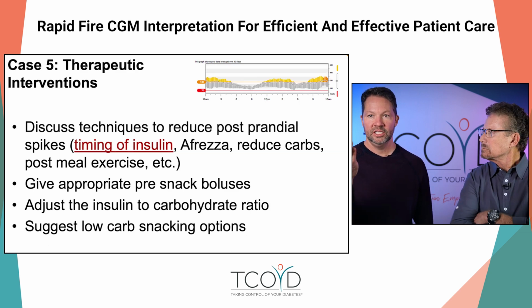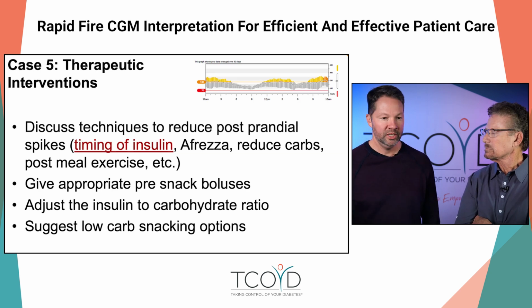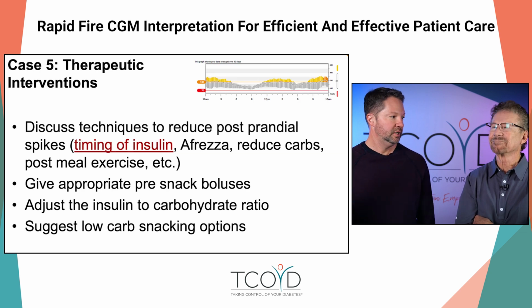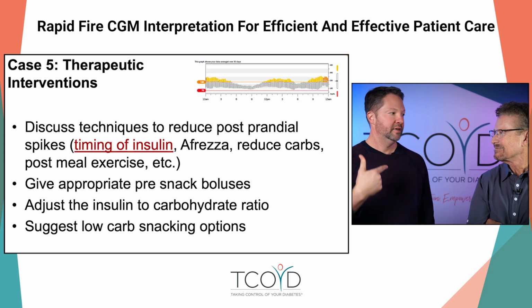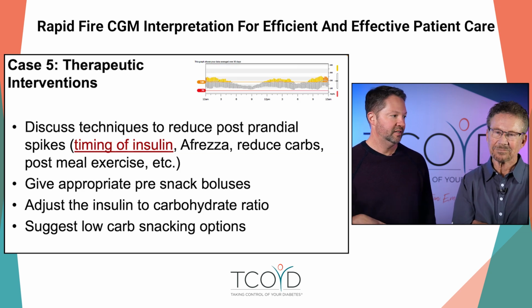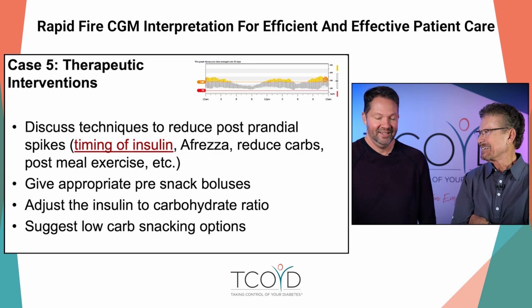You're right. And when I actually see this download, snacking is what I usually think of. And I tell people the human being usually eats a small breakfast, medium lunch, big dinner, and then mindlessly eats between dinner and bedtime. And we kind of convince ourselves that those little snacks don't count. Oh, it's 3 crackers, it's 4 grapes, I don't need to take insulin for it. But it adds up, and then you go high and you're high all night. No one eats just 4 grapes.